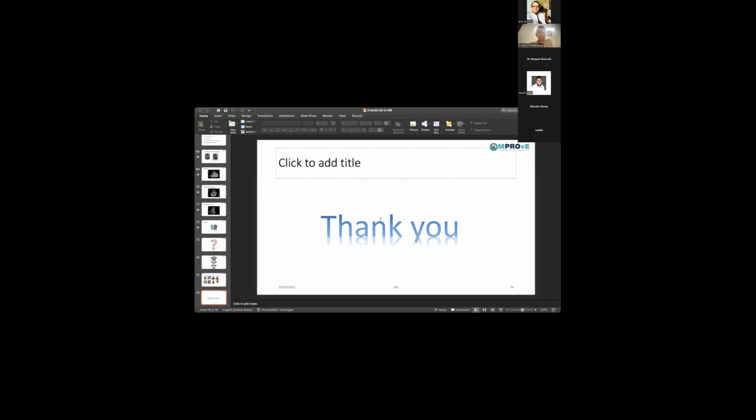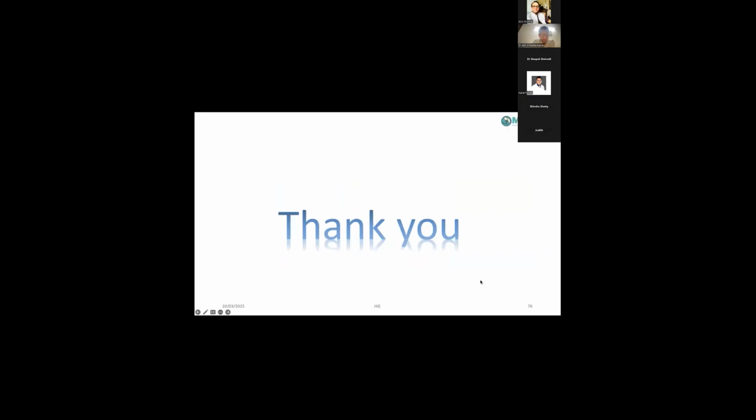Good evening. Thank you so much for your presentation, Dr. Bhattacharya. Just two quick questions. One is regarding the ultrasound cranium. My department does not have an ultrasound of its own, and we probably don't have the liberty to do sequential ultrasounds. So according to you, what would be your one, two, three go-to findings for an HIE? Whether it's a fuzzy brain, or the resistive index?